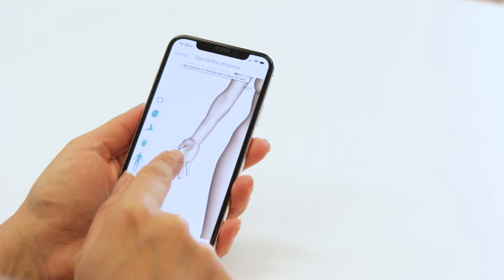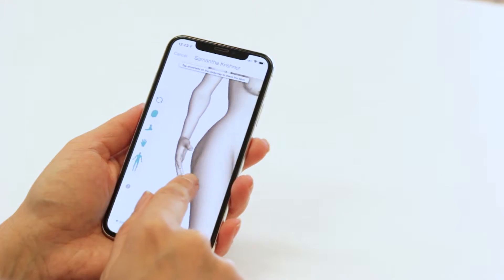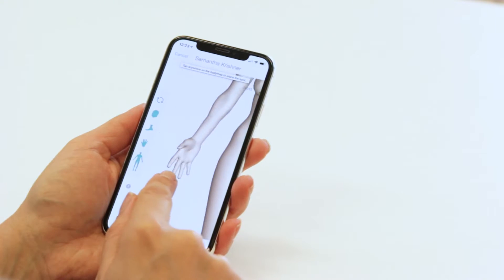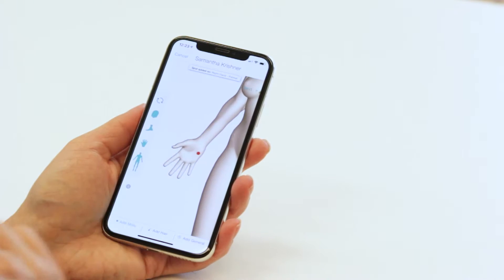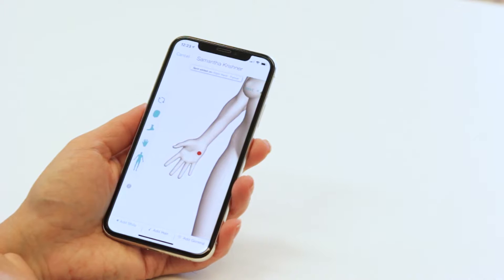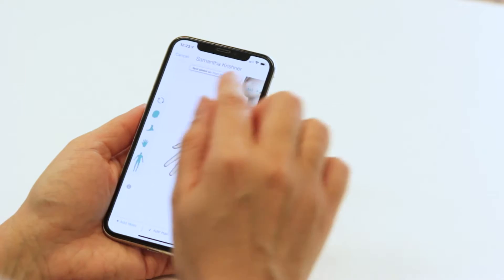Tap once to add the spot. If you wish to adjust the placement, simply tap another area to move it. Then hit next.